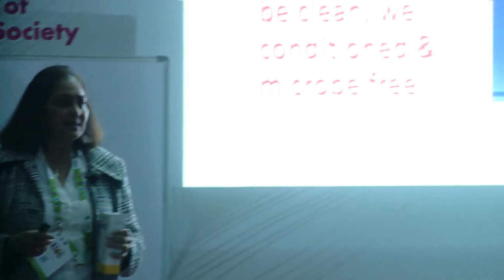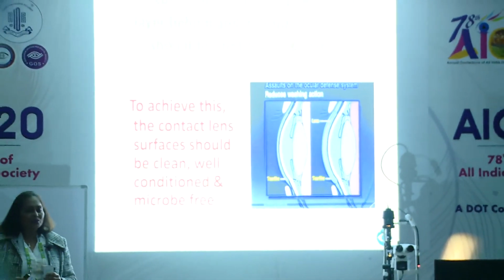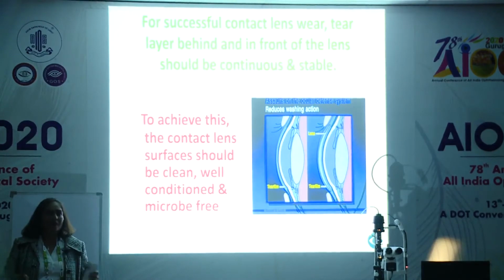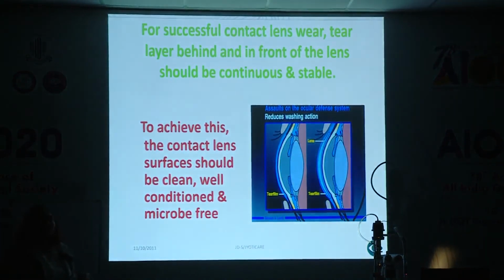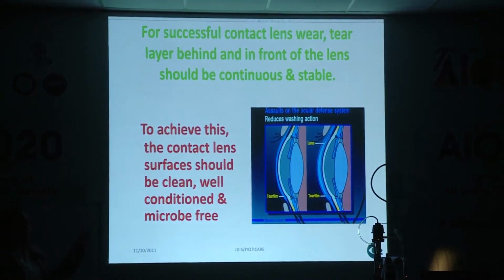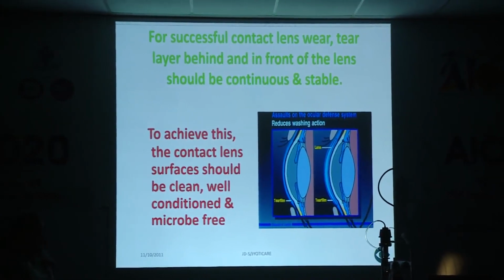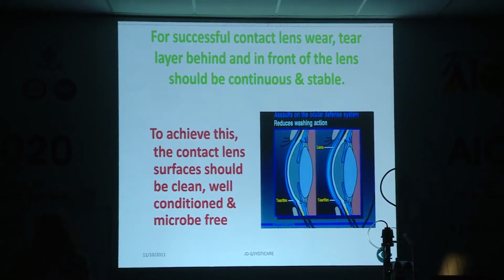As you wear lenses, the lenses collect a lot of deposits, and to make sure that the lens feels comfortable, especially on an irregular cornea or myopia control lenses, you need to make sure that the surface of the lens is completely coated with the tears in front of the lens.